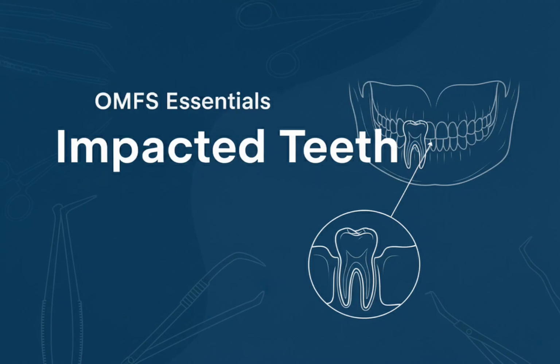Having covered patient evaluation, we now move to the surgical procedure for removing an impacted mandibular third molar. The procedure is a systematic sequence of steps: creating access, removing bone, sectioning the tooth, preparing the socket, and closing the wound. Today, in Part 1, we focus on establishing safe access and managing hard tissue through bone removal and odontectomy. Incision and flap design.